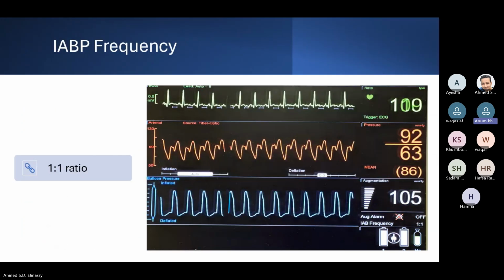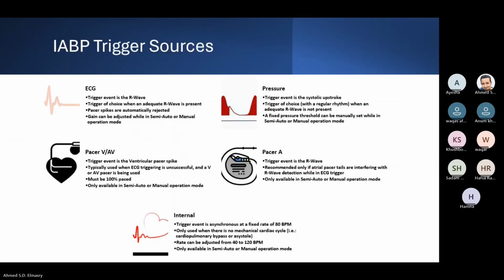But if you have to use it, you can do one thing. One study showed that, as you already said about the trigger, if you set the trigger to the arterial waveform, then it can synchronize well with the pressure waveform and work along with the CPR compressions.